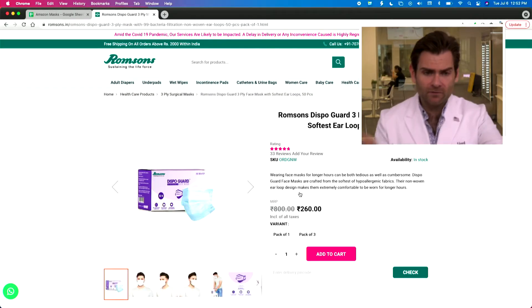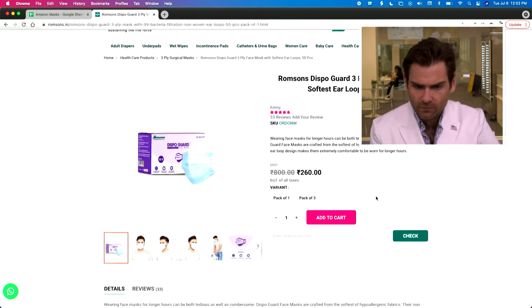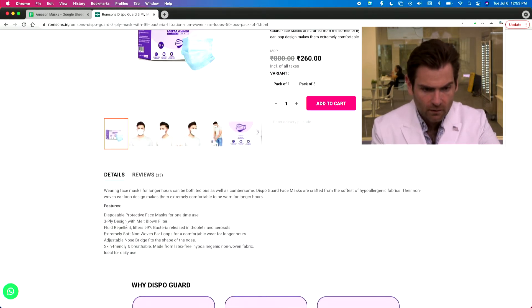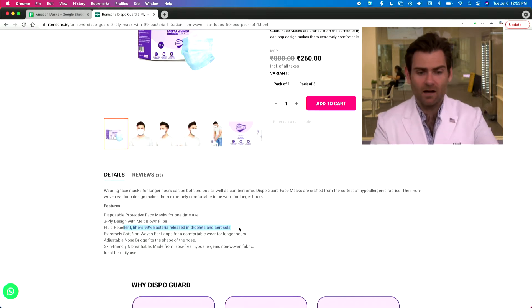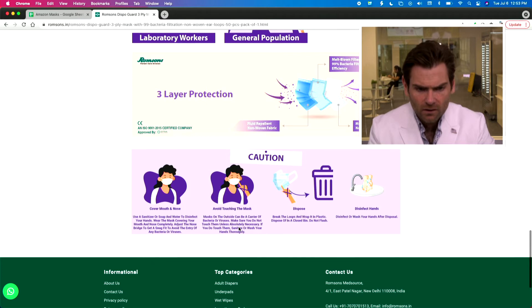Romsons Dispo Guard — it's like a play on 'disposable' and 'guard,' I like it. Looking at their website, romsons.in, the Dispo Guard has soft ear loops, hypoallergenic fabric, fluid repellent, and filters 99% of bacteria released in droplets. We've talked about this before — let's see if there's anything else on here.